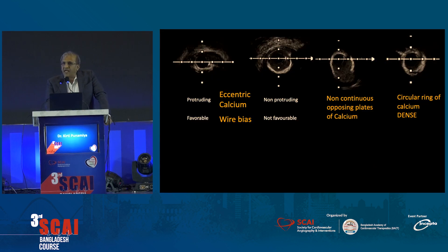Looking at these IVUS images, you see a circular ring of calcium to the right — dense calcium. This is probably not the lesion that actually stopped the catheter, because the nose of the catheter has gone beyond it. There are non-continuous opposing plates, and then there's eccentric protruding calcium — calcific nodules or non-eruptive nodules. These are important because we need to look at favorable wire position: this is a non-favorable wire position, and here the wire is tucked into the lesion, which is a favorable position.